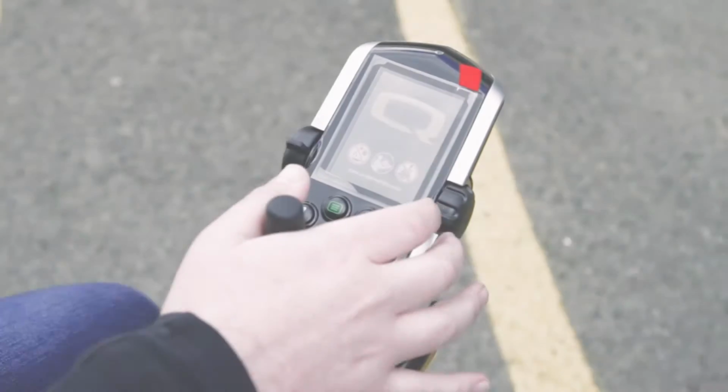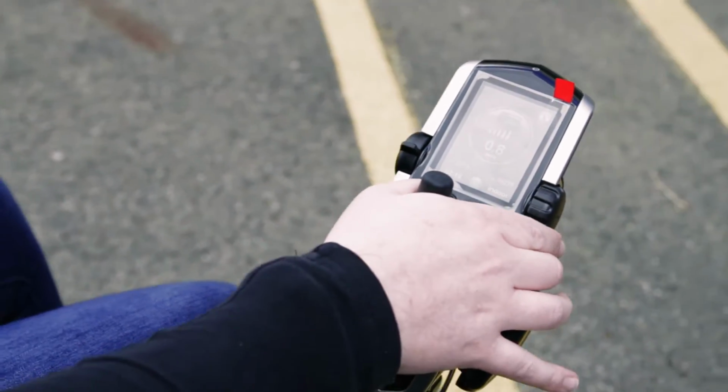For some who struggle to access the buttons on the controller, you can rotate the controller. And for some, they might end up using the attendant control, which is 2 easy to reach buttons, and you can angle it so that they can reach the buttons.